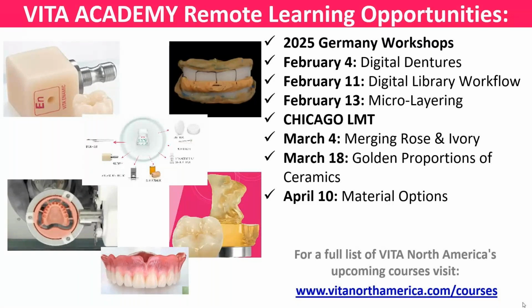I have to manage that with my substructure material choice, meaning how much opacity or value do I need, and then my layering process. As an example, implant number 8, crown number 9. I'm building that number 8 to get out to the same position as the final coping in my number 9, usually with more opacified materials, maybe more fluorescent materials, to create similar working canvases before I start my dentins and enamel buildup. So if that's what you were going for in the question, that's the way I would usually manage it.